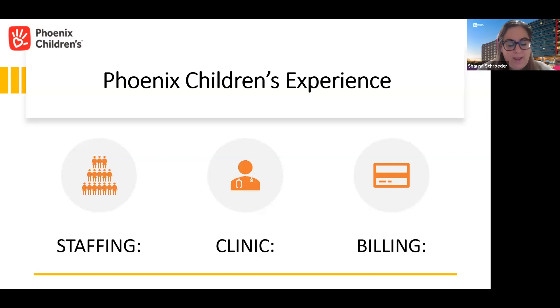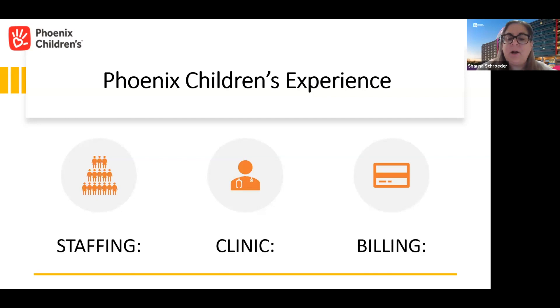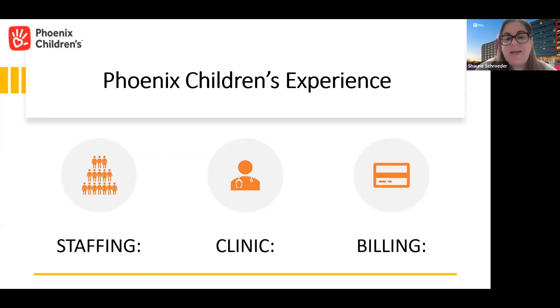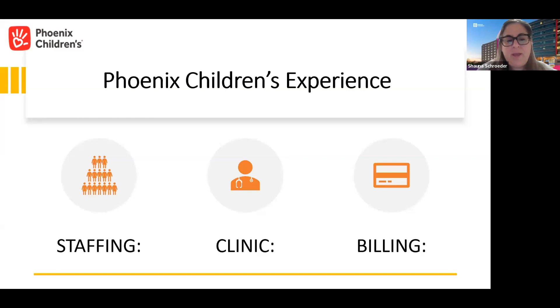I set up a specific esophageal clinic where I'll see patients back to back and just place strings all morning — usually about 8 to 12 patients in a setting for the day. I have a medical assistant who's amazing. I start each visit by making sure patients are taking their medications and finding out current symptoms — almost like a short office visit — then we have the patients swallow the string. They go to the waiting room for an hour. I also have staff from the lab come up to help with collection and immediately freeze the sample, and once batched, they send it to the reference lab in Denver, Colorado. As an academic center, I also offer research collection with a lab and research coordinator.